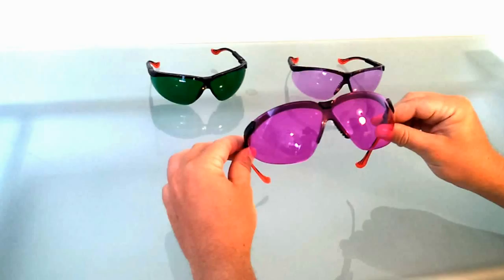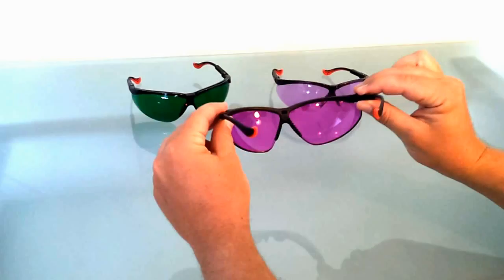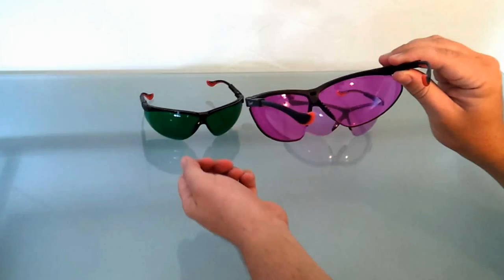Hey everyone, today we're demonstrating the O2 Amp Phlebotomy Glasses. These glasses are a breakthrough in the phlebotomy industry. O2 Amp lens technology is patented and based upon research from two AI labs. These glasses in front of you are the Oxy Iso models, and while wearing them, they isolate and enhance the perception of blood oxygenation under the skin.